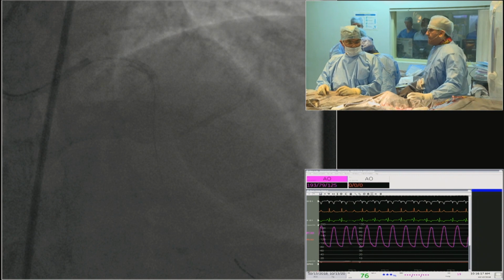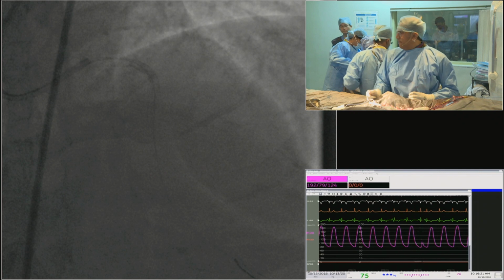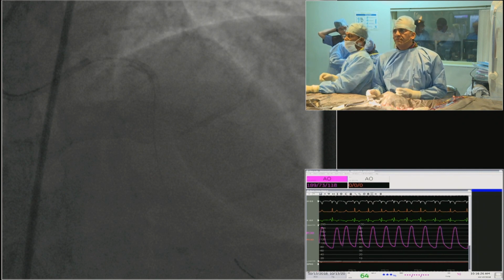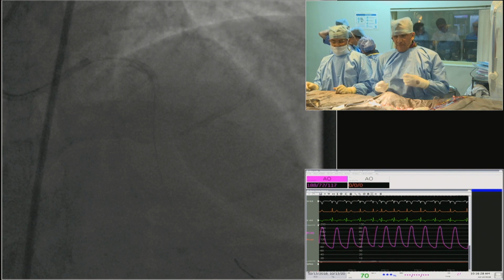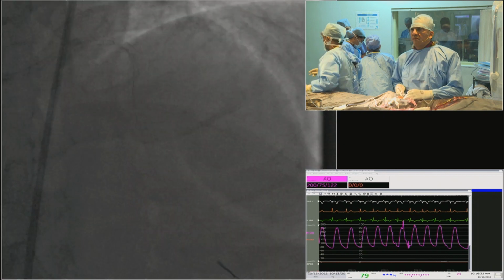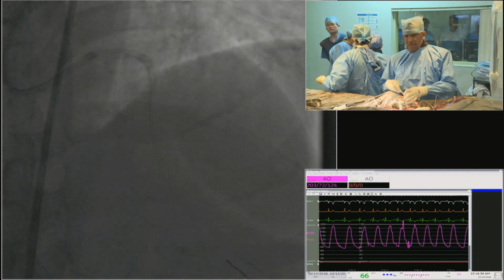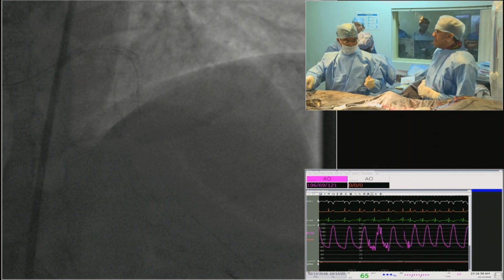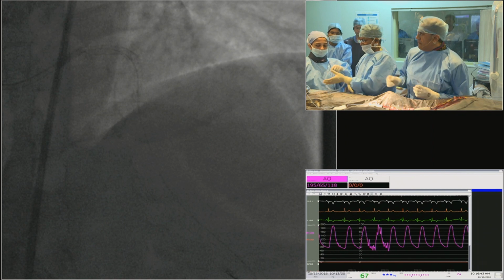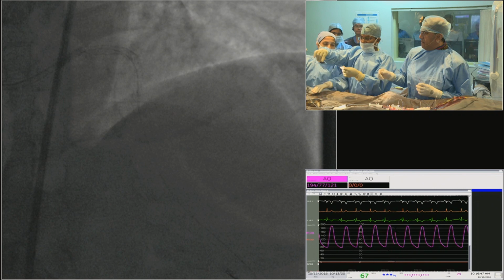In fact, it is to the contrary. As you overexpand the stent, that zigzag pattern becomes straight. It becomes more rigid. The radial strength of a stent increases as you overexpand it. However, since it is more rigid, it is more likely to wear and tear and fracture. Yeah, sure. So stent distortions are a reality we can't run away from, and your point is well taken.